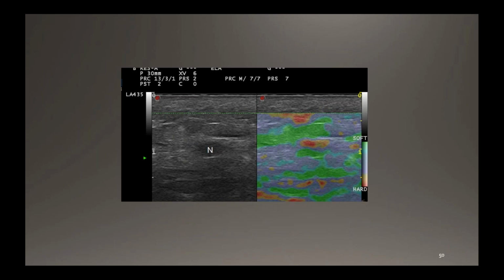with elastography, we were able to detect this subclinical, sub-B-mode lesion that flares up in red, which in our equipment means hard, and permitted us to detect this micrometastasis. As I told you, early detection in melanoma is key because it gives the patient the opportunity to have a very long survival with new treatments. Early diagnosis is key, even in this millimetric metastasis that will require systemic treatment with new treatments.